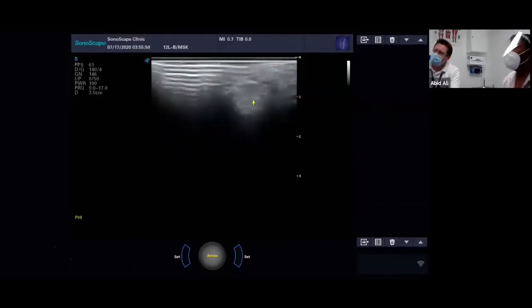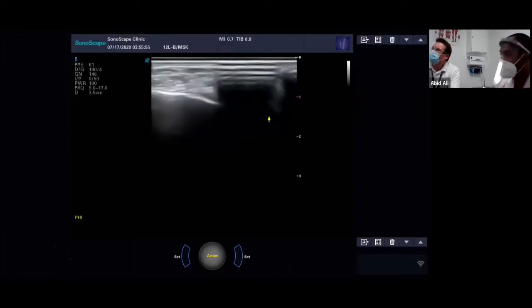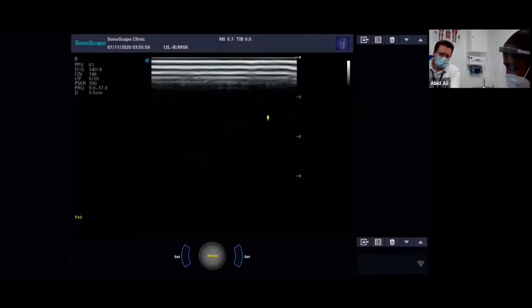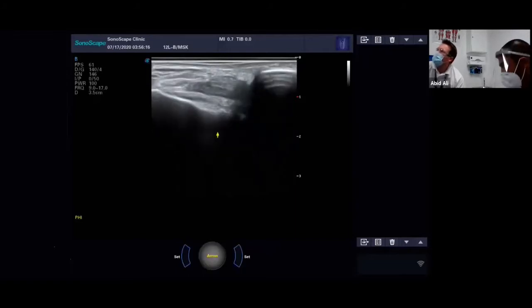And that's that. While we're there, we could do the CFL if we like. So you need loads of jelly because you've got the contour of the lateral malleolus and it sort of drops off there. So to get your CFL, you need plenty of jelly in the middle of that malleoli and the calcaneus. We want to put our probe pretty much on the tip of the fibula.